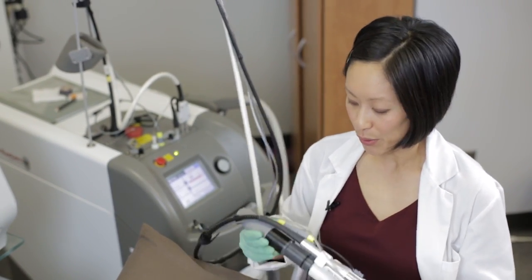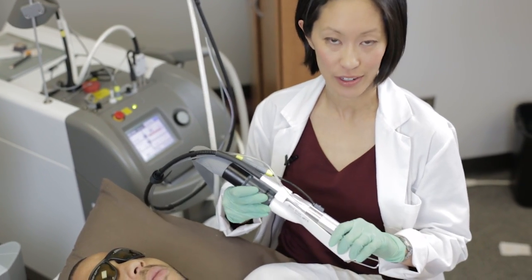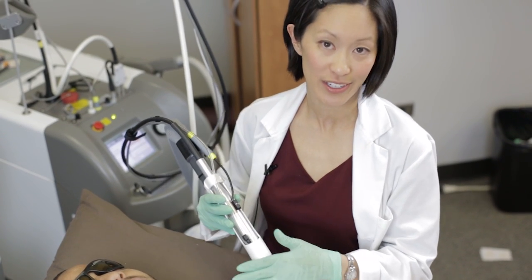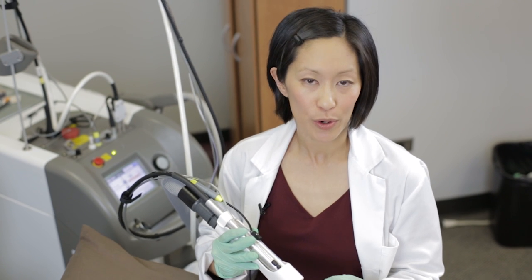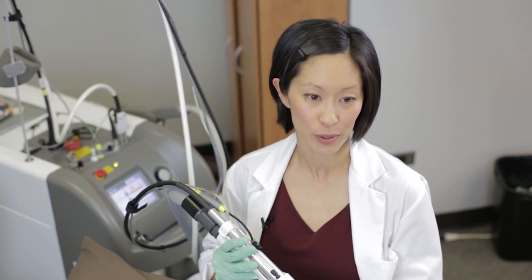With laser hair removal treatments, you always want to use some kind of cooling. We have the Zimmer cold air blower connected to our handpiece here, so that at the same time of the treatment, there's also cold air blowing onto the skin. The cooling is for two reasons: one, for patient comfort, but two, more importantly, to protect the surrounding tissue — in other words, the skin or the epidermis that surrounds the hair follicles that we're treating.